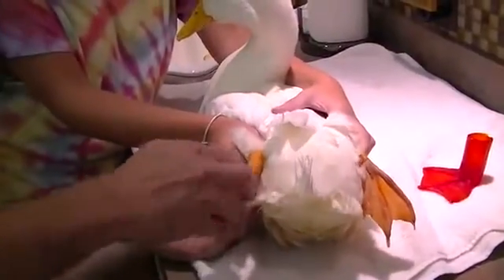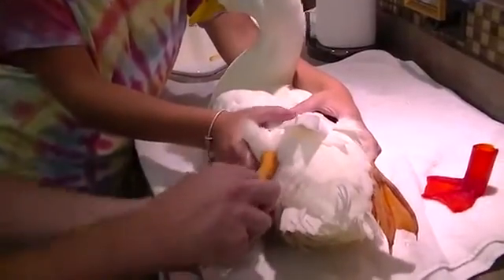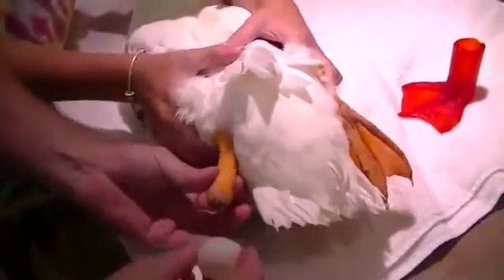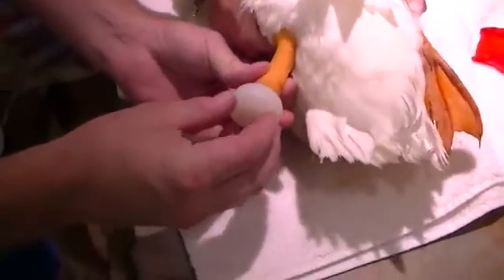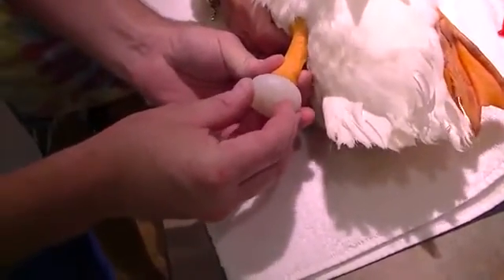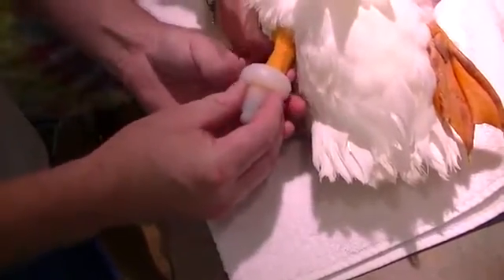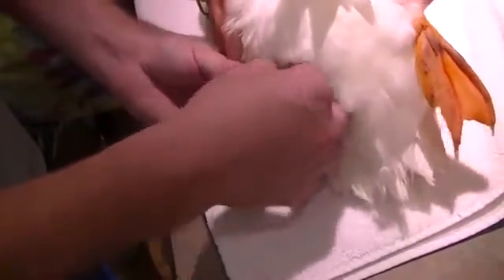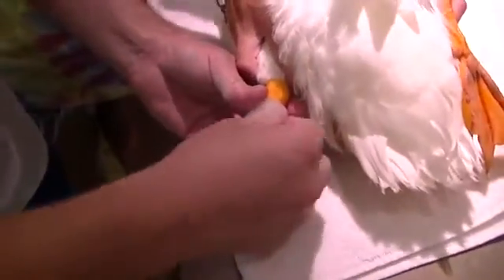All right, here's what we've all been waiting for. I'm looking at the center of Buttercut's leg and I'm lining up the sock. I'm going to roll it up on his leg like so. Get the feathers out of it. There's the sock.